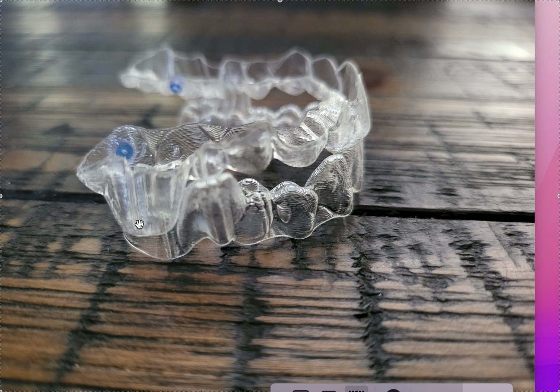Okay, so the patient has to still be growing or it's not gonna work, so don't bother. So find that out first. Then we're looking for patients that need mandibular growth. How do you know? Well, you're not gonna know unless you take a Ceph, okay? And you need to interpret the Ceph, which means you need to run the Ceph through the numbers and get the norms and get the standard deviations. That is how you do it. I mean, clearly I can look at a patient's face and tell you if they need to grow a jaw. But if you're gonna grow a jaw, you really need to take that Ceph as a baseline.